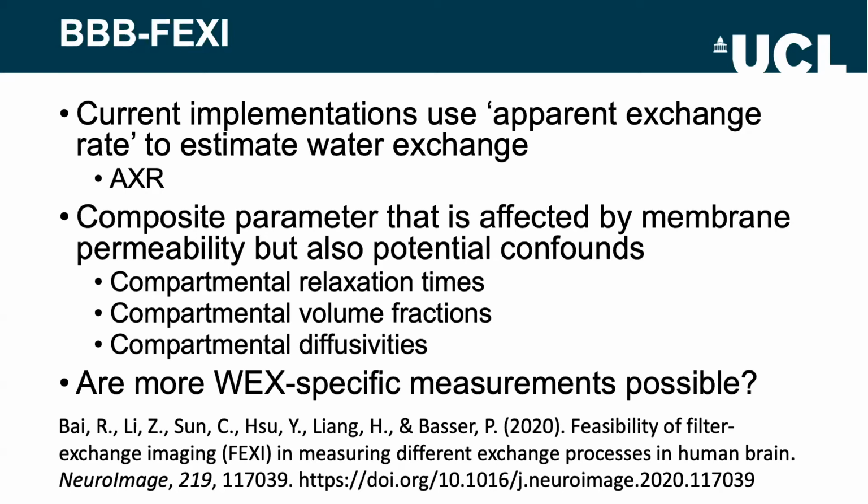generally estimate something known as the apparent exchange rate as a proxy for, if you like, the true rate of water exchange. And so this goes by the acronym AXR, apparent exchange rate. And it turns out that, as is shown in a paper that I'll reference in a moment, AXR is only an approximation of water exchange.